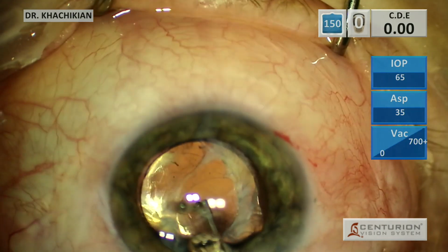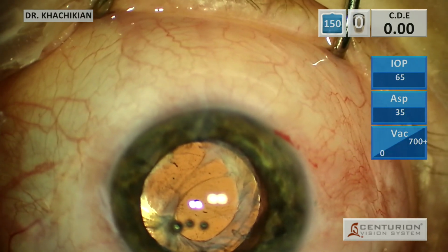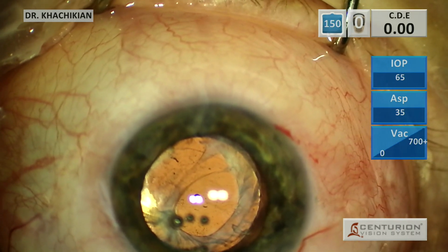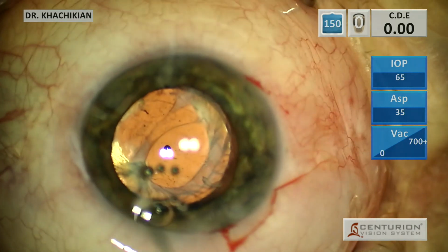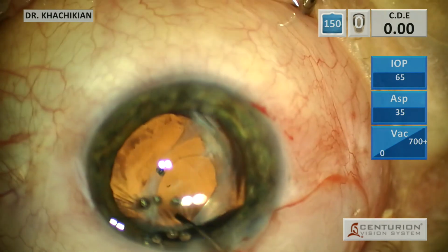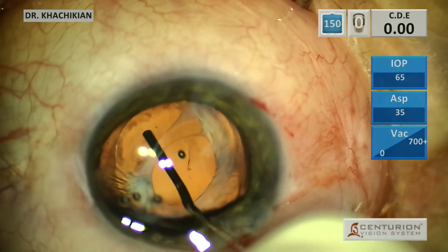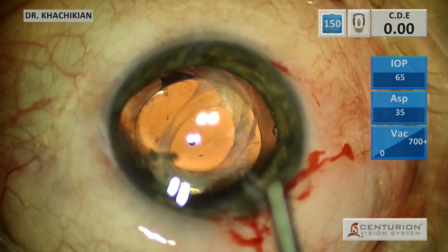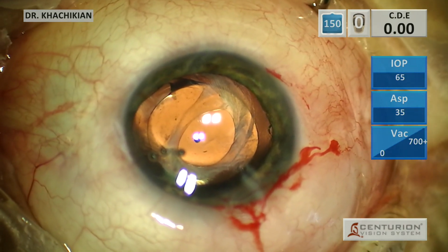So now I think we've got this freed up all the way to the capsular fornix. The next step, I think, is that we should really try to either leave the lens in or remove it and put in a capsular tension ring, because we want to keep this capsule open. You can see on the right that the haptic is pretty far expanded, maybe not 100% into the fornix, but pretty far, both nasally and temporally, or left and right in the view.